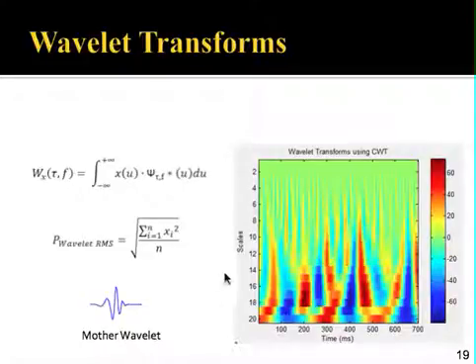So, for example, if we look over here at scale 14 and scale 12, there would be a frequency range in hertz that corresponds to each. I'll just pull some numbers out of my head, completely arbitrary. Let's suppose that scale 12 corresponded to 8 to 12 hertz. Scale 14 then might correspond to 6 to 10 hertz. So there's some overlap. That's known as redundancy, and that's one of the issues with the wavelet transform: from scale to scale you're not necessarily getting unique information.